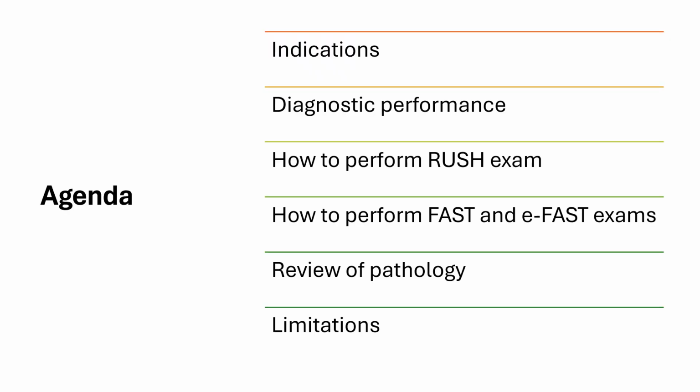We are going to talk about the indications for both RUSH and FAST exams, review the diagnostic performance, discuss how to perform RUSH, FAST, and e-FAST exams, and understand that there is some overlap between the two. We'll review the pathology and finally discuss some of the limitations.